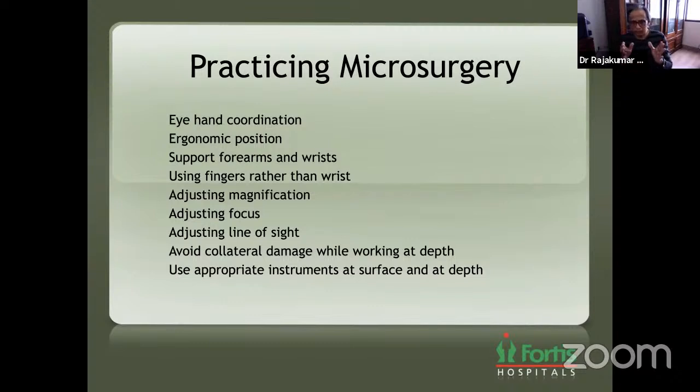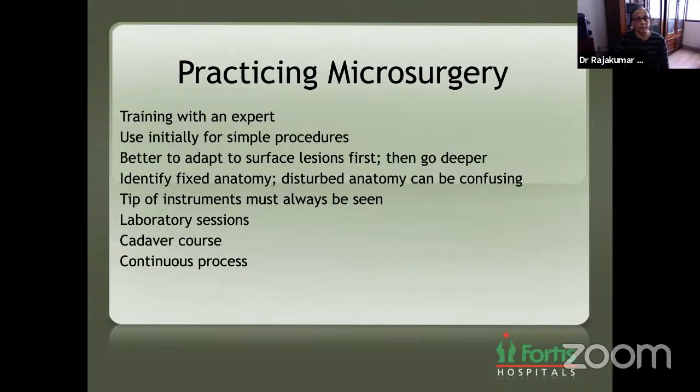Good surgeons who just gave you all the minimal access work prior to my talk actually use all these things subconsciously. They don't look at it. They do it as though it's an extension of their eyes and hands. But to come to that, it requires some degree of proficiency. So how do you learn microsurgery? You start assisting an expert, get a proctor, start doing simple procedures, do more surface lesions and near to the surface, and then go deeper.